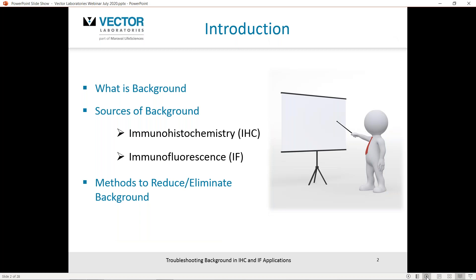As a bit of an overview, we'll look at what is background for those of you who may be new to the field. We'll look at sources of background you may encounter with immunohistochemistry and immunofluorescence, and we'll look at methods and strategies to help reduce or hopefully eliminate background.